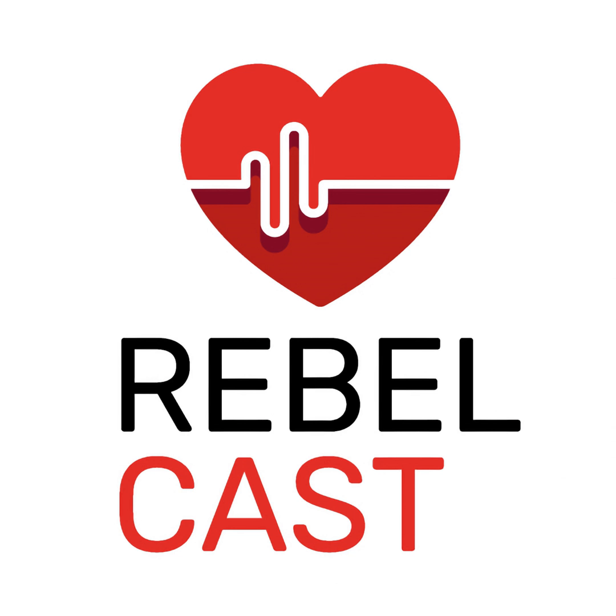So we give them the benefits of pressure, which is physiologic. There's comfort because it's a decelerating waveform, but we're also in control with the set tidal volumes. It combines some of the benefits of pressure and the benefits of volume together in one breath. Now, there's some downside to using PRVC, and there are some safety features as well.